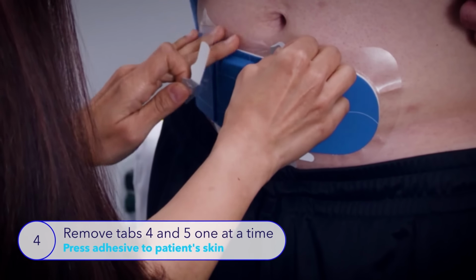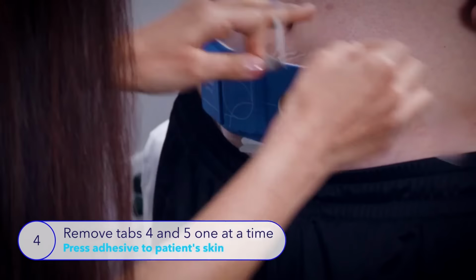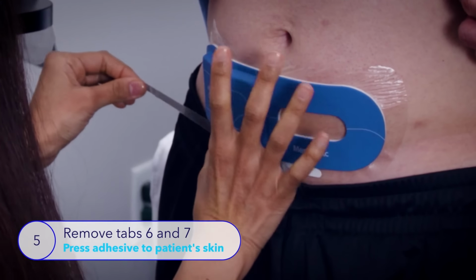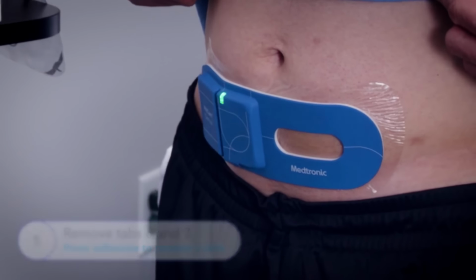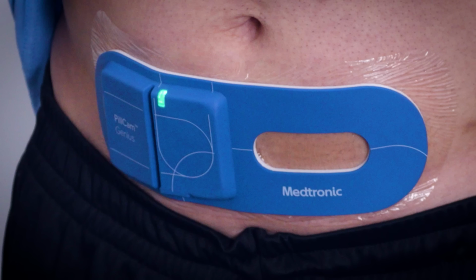Next, remove tabs 4 and 5 at the top of the device, one at a time, pulling from the center to the right and left, respectively. While removing, smooth the adhesive against the patient's skin. Now remove tabs 6 and 7 at the bottom of the device, again, one at a time, pulling from the center to the right and left, respectively. As before, smooth the adhesive against the skin as the tabs are removed. Once the link device is securely applied to the patient's abdomen, the patient is ready to ingest the capsule and begin the procedure.